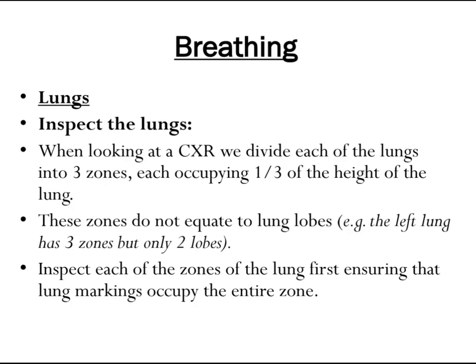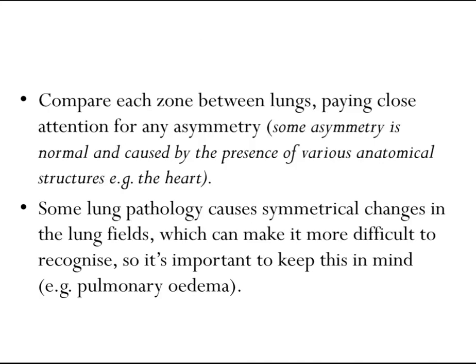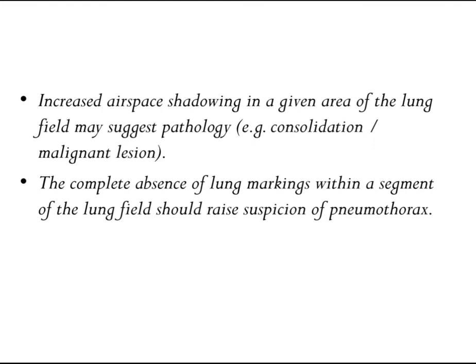B is for Breathing. Inspect the lungs — when looking at a chest x-ray we divide each lung into three zones, each occupying one third of the height of the lung. These zones do not equate to lung lobes, as the left lung has only two lobes. Inspect each zone ensuring that lung markings occupy the entire zone, and compare each zone between lungs paying close attention for asymmetry. Some asymmetry is normal due to anatomical structures such as the heart. Some pathology causes symmetrical changes, which can make it more difficult to recognize — for example, pulmonary edema.